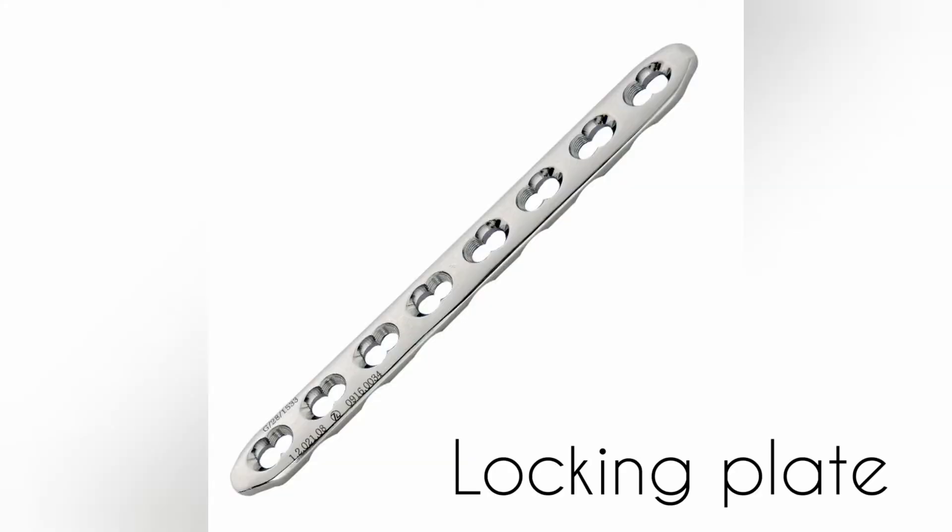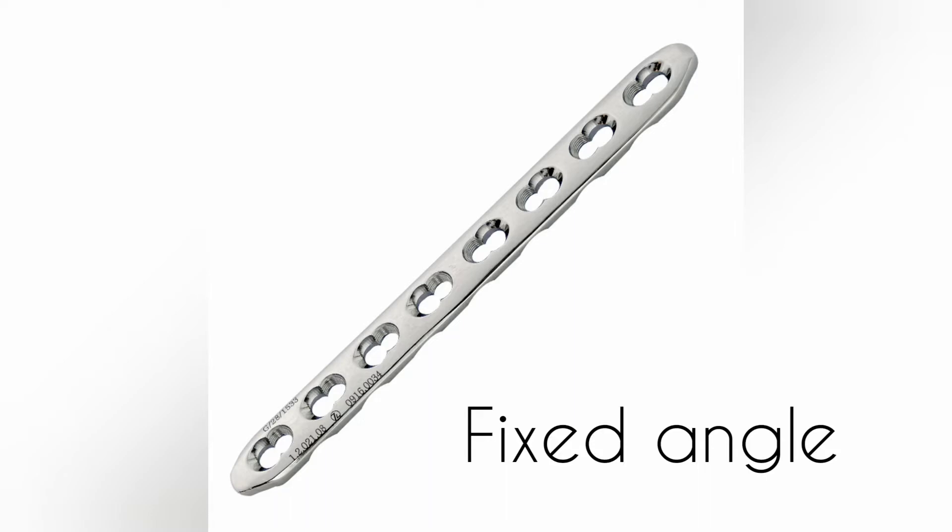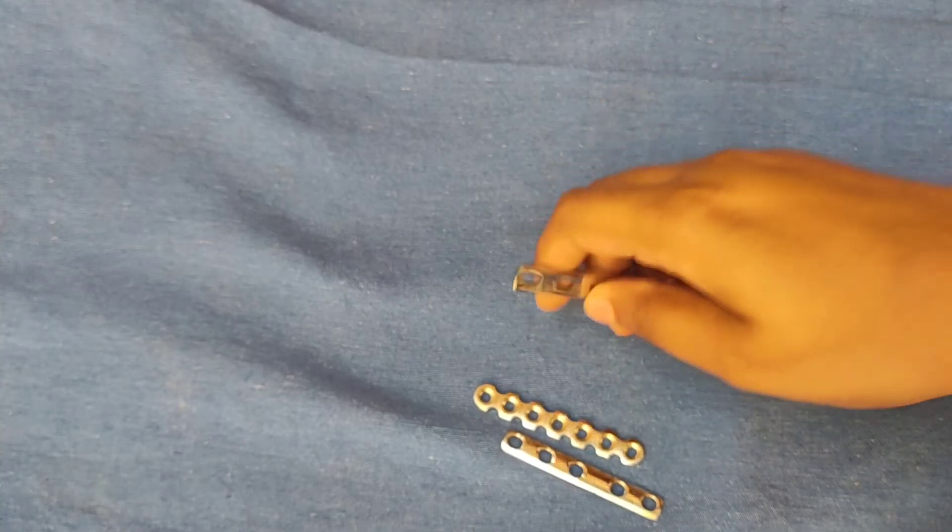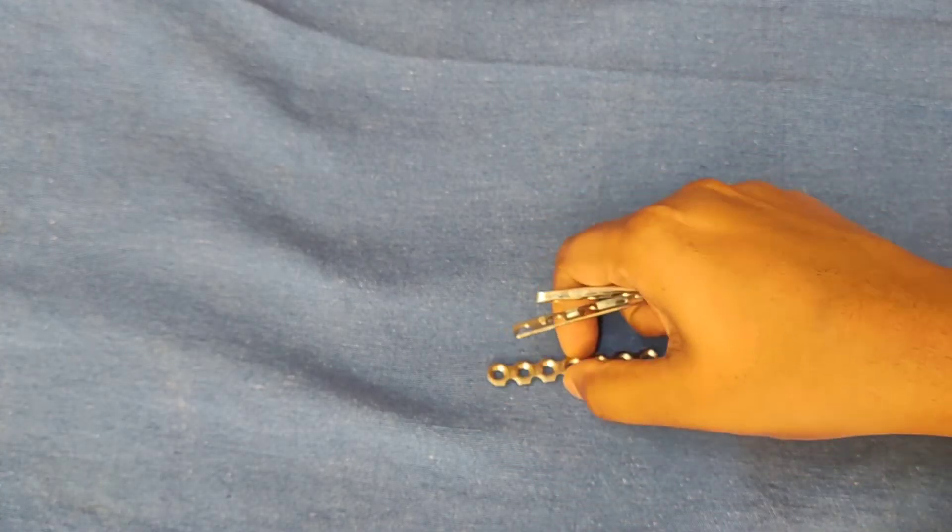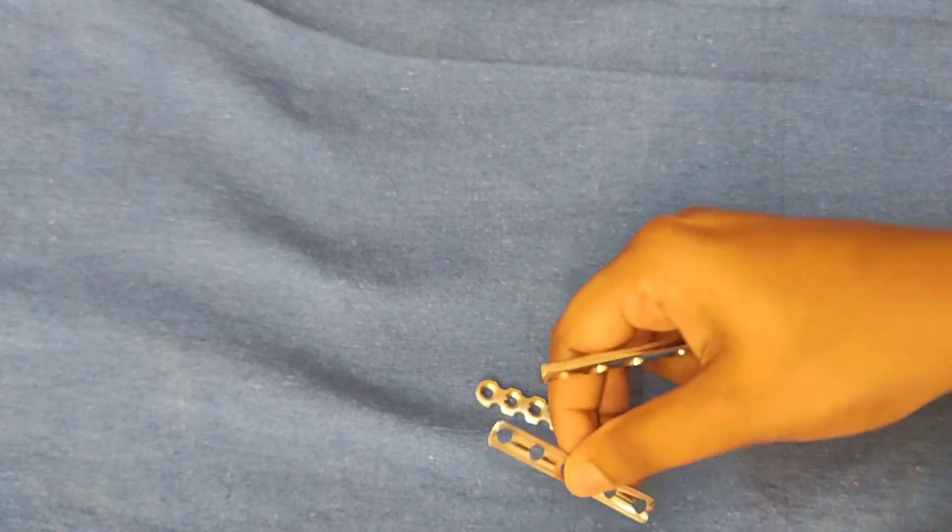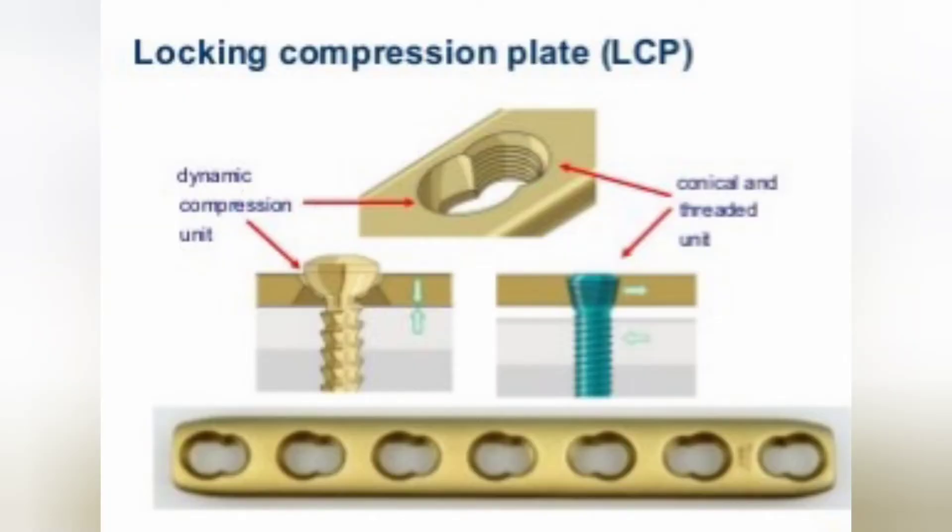Next is locking compression plate. Locking compression plate is a fixed angle construct where screw head is locked into the plate. The stability of fixation occurs at screw plate interface. There is no contact between plate and bone interface so it will not hamper periosteal vascularity.